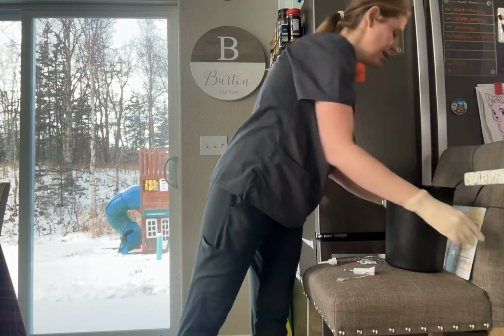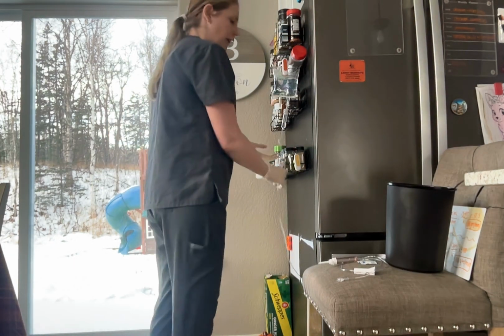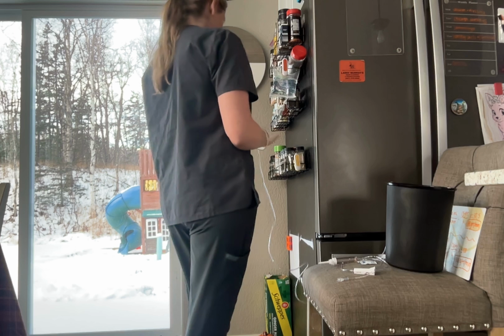So now I'm going to count for 60 seconds, and I'm going to calculate the flow rate at 38 drops per minute.